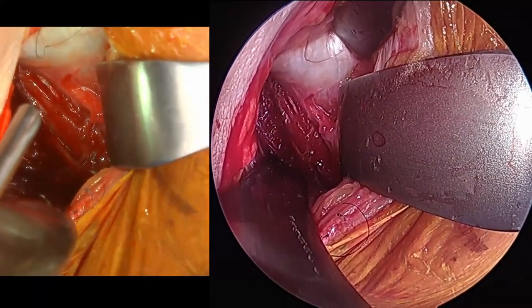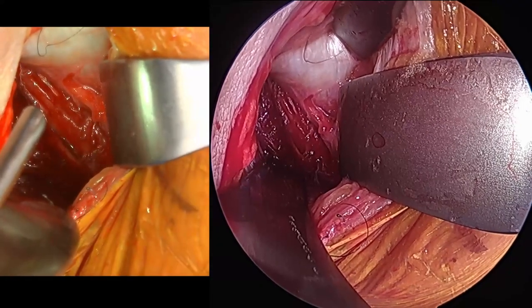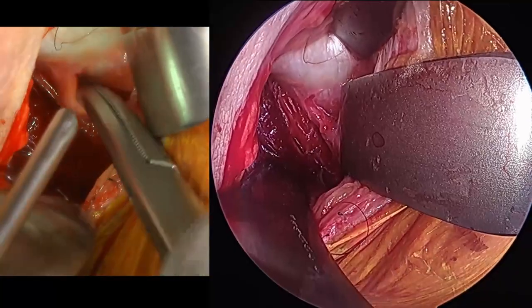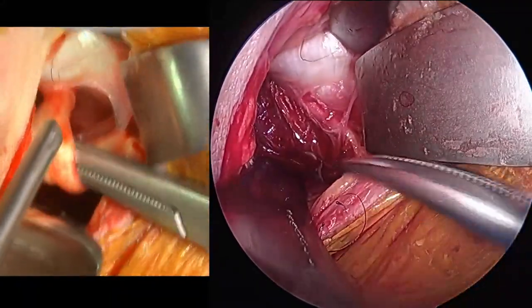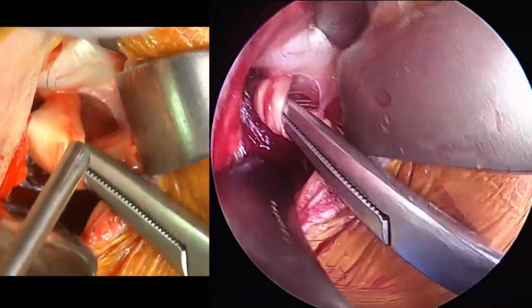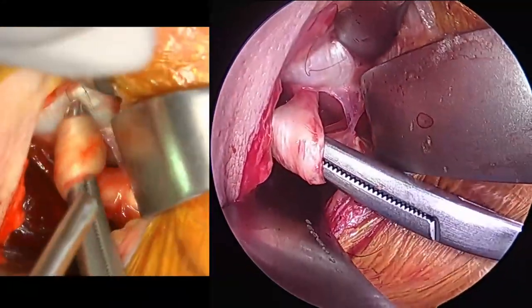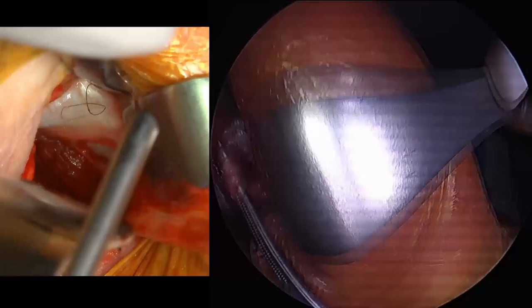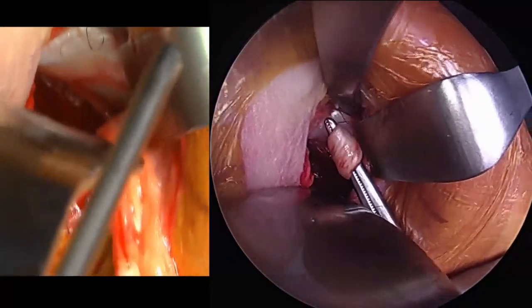I can take this, thank you. And Deb's going to pull back for a second, and we're going to go down to the biceps, which is right here. I think we can see that, right next to the pec. And then as we lift that out, there's our biceps tendon.